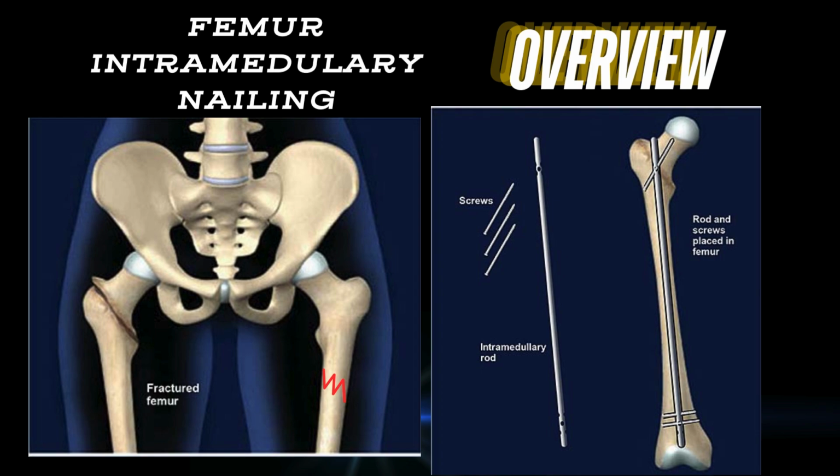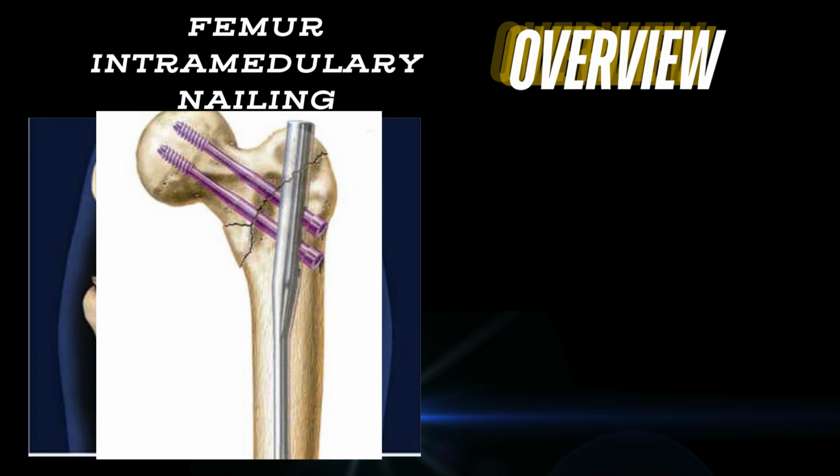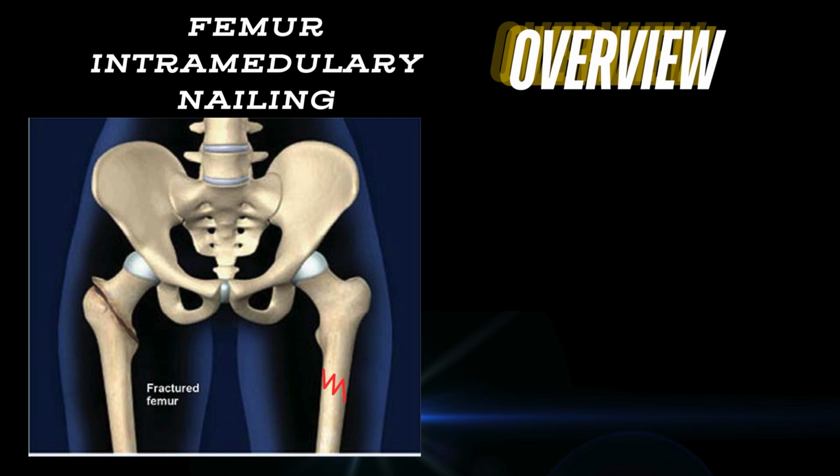Intramedullary nailing is surgery to repair a broken bone and keep it stable. The most common bones fixed by this procedure are the thigh bone, the shin bone or tibia, the hip bone or proximal femur, and the upper arm or humerus. A permanent nail or rod is placed into the center of the bone. It will help you be able to put weight on the bone.